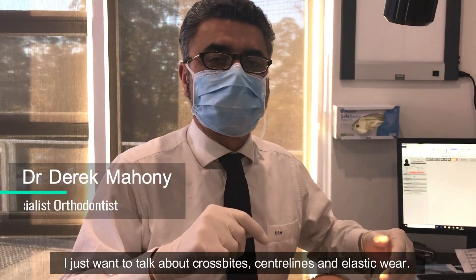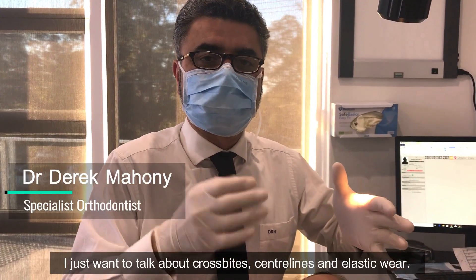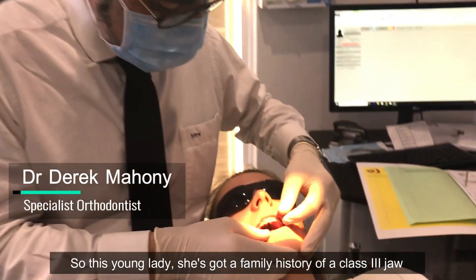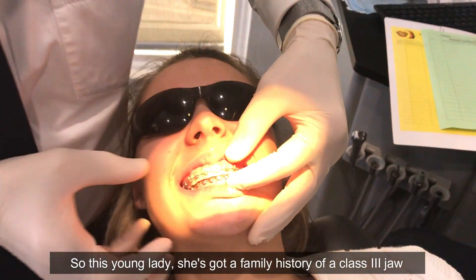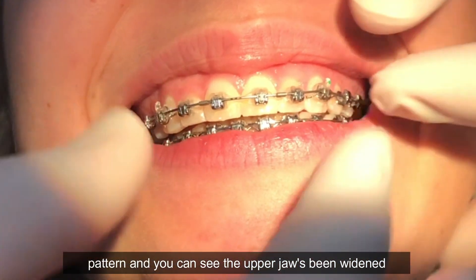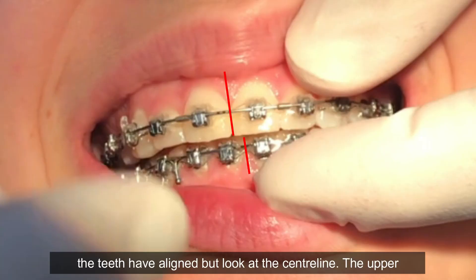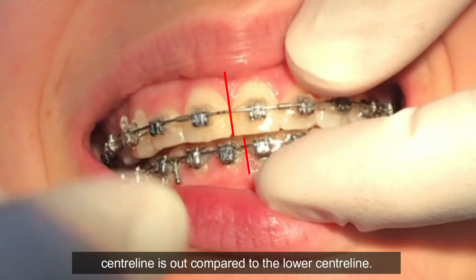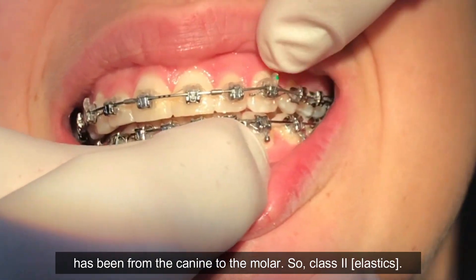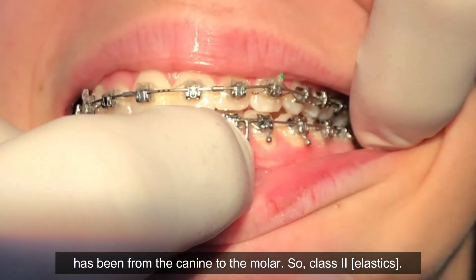I just want to talk about cross bites, center lines, and elastic wear. This young lady has a family history for a Class III jaw pattern. You can see the upper jaw has been widened and the teeth are aligned, but if you look at the center line, the upper center line is out compared to the lower center line.